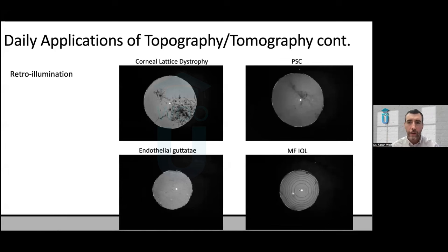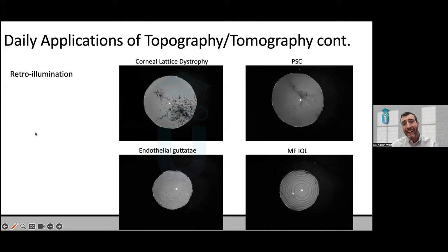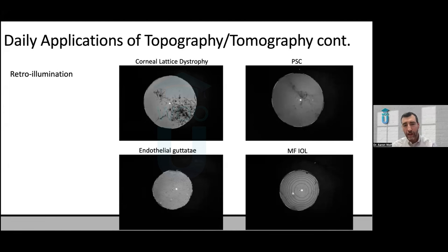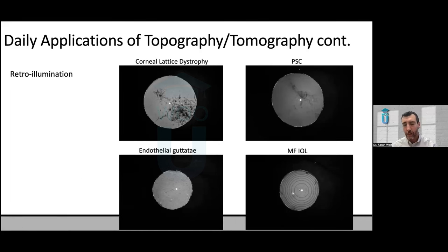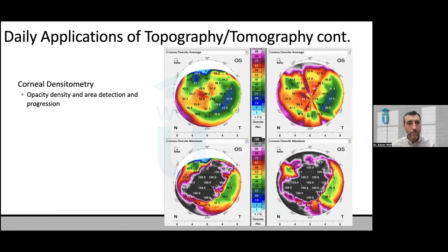Some devices offer retro illumination with infrared imaging — a great way of seeing corneal dystrophies, PSC cataracts, and other subtle findings that can be difficult to see at the slit lamp. Because infrared is invisible light, the patient's pupil is wide open, making it much easier to see subtle PSC compared to using the slit lamp where the bright light causes the pupil to clamp down. These devices also show guttata very nicely as tiny little black dots, which can be very difficult to see at the microscope.